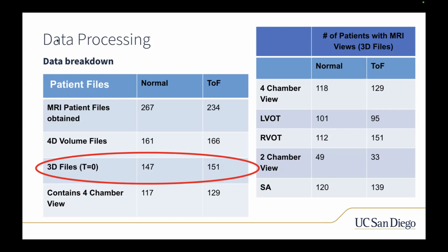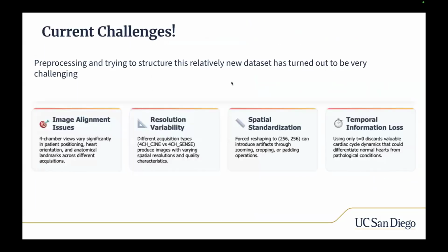These are all 2D images, and then we had to create a 3D image from a bunch of stacks, using slice times, trigger times, and their locations, combining them to form a volume. Even then, they were not aligned. If you go to the very last supplementary slide, you can see it.